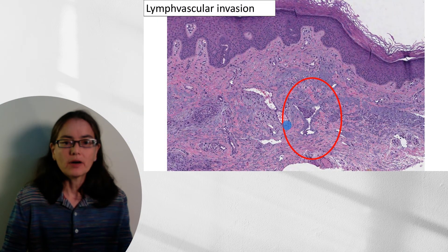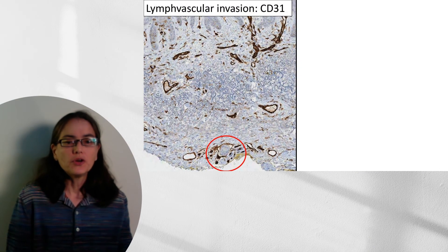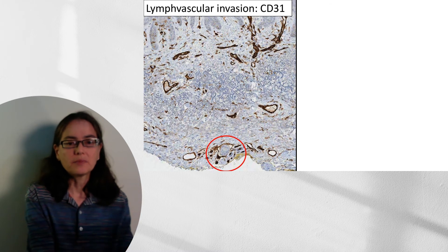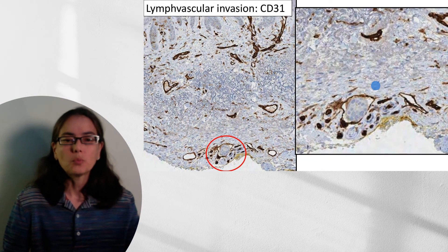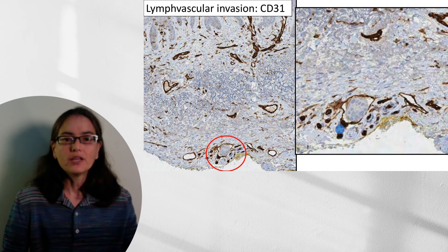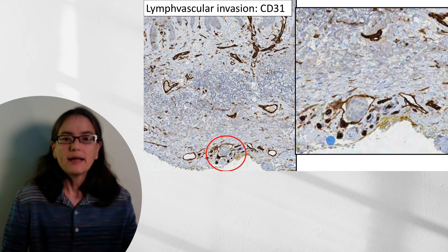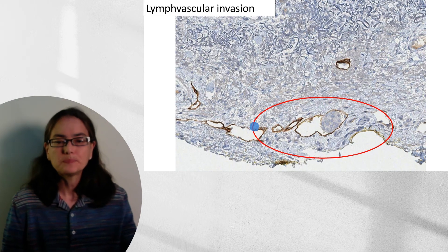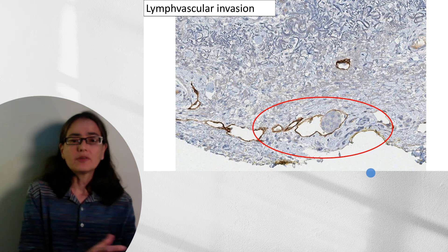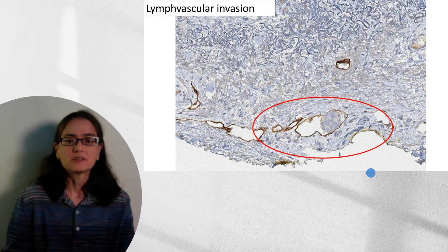On higher power, we can see exactly where that tumor is. As an aside, pathologists use special stains to confirm vascular invasion: CD31 is specific for endothelial cells and highlights blood vessels in the dermis, including around the bit of tumor. Another stain is specific for lymphatic vessels. You may see in a pathology report that with special stains, lymphovascular invasion was identified.